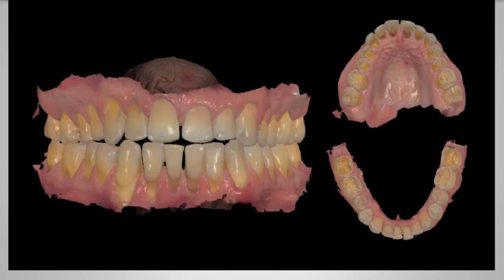Another usage of digital is to utilize it from a treatment planning standpoint. I still use impression material in my practice for different things. In many implant cases, I use traditional impression material. In Invisalign cases, I use traditional impression material. And there are other times where maybe the wand doesn't fit, so you might have to use traditional impression material. But in cases where I'm using digital, I can also use digital from a standpoint of treatment planning modalities and leveraging this technology for treatment plan presentation.